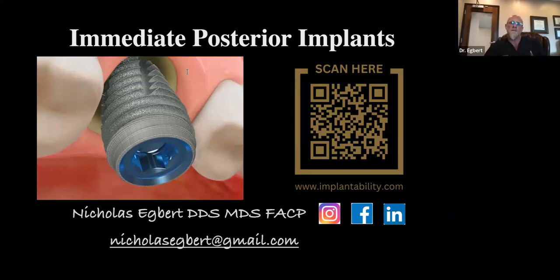Sometimes it's a combination of Dennis Tarnow's ice cream cone technique, where you can sneak that little membrane up underneath. You can place bone in that site and then screw down your membrane. Dr. Barry Levin out on the East Coast teaches a dermal apron technique, which is basically you make your temporary crown that's out of occlusion with proper emergence profiles, and you take a small piece of dermis and you place a hole. Think of it like a biopsy punch, drape that over the temporary from basically the intaglio down, screw that in, and then you can tunnel up and tuck it underneath. Lots of different ways to do that. I'd recommend you consider taking the advanced course if you're interested in that.